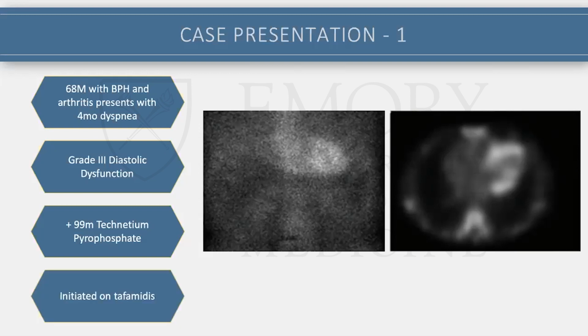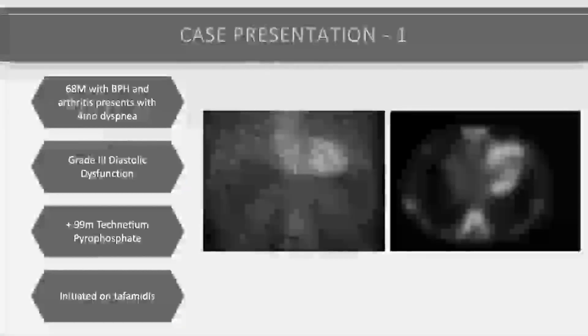This was just a few months ago, so he's actually ended up being a really interesting case. He's got terrible arthritis, and his rheumatologists think that's amyloid arthropathy with joint erosions and things like that. So he's early on in his treatment course, yet to be seen if the tafamidis will make a difference or not. But certainly an interesting case, and I think one where, although certainly not the only factor, his echo findings of severe diastolic dysfunction were part of what tipped the team towards pursuing this workup for cardiac amyloid.